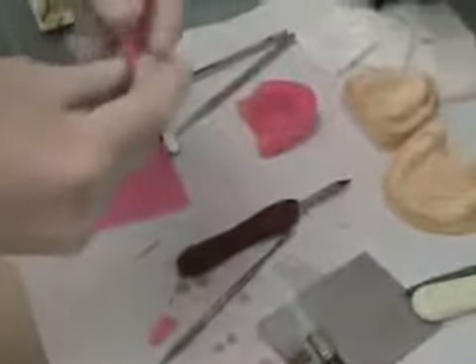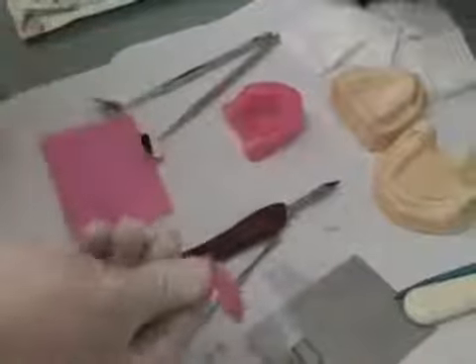Use your knife heated so that it cuts very efficiently, so you don't have to use force, and it's a good idea to use a finger rest to make sure that you don't cut yourself. If you need to add quite a bit of extra wax, soften your wax, cut it, roll it up so you have a larger thickness of wax to add on. Make sure that the wax is dead soft. Use your alcohol torch or Hanau torch or your Bunsen burner. Then roll it up so it's several thicknesses thick. Soften the wax. Then place it on the rim.